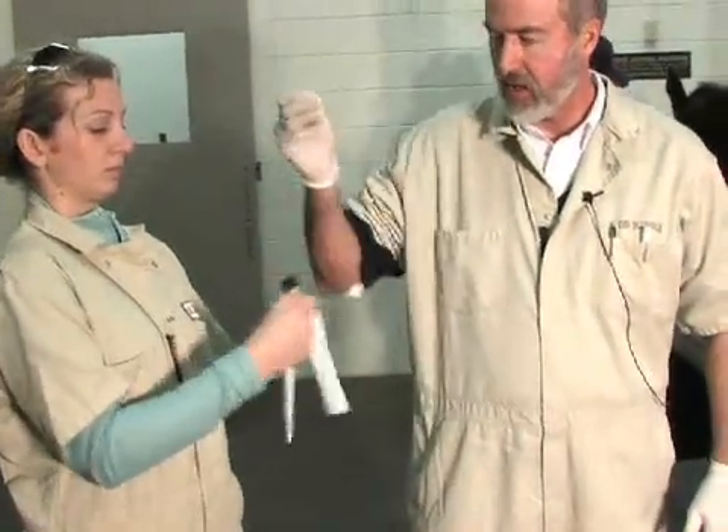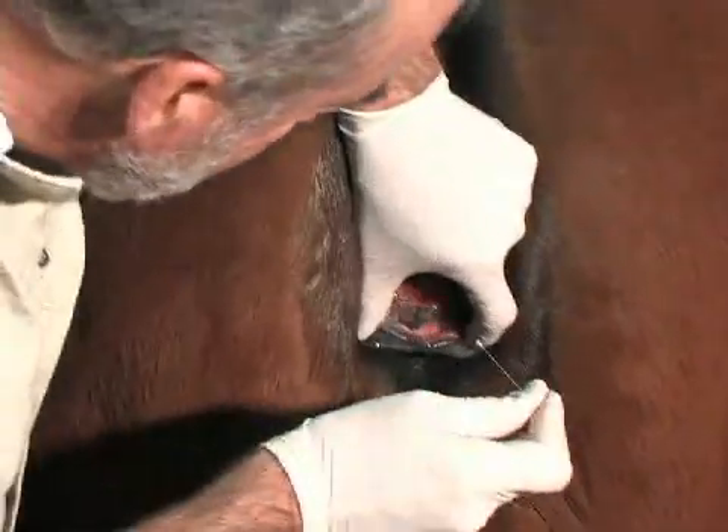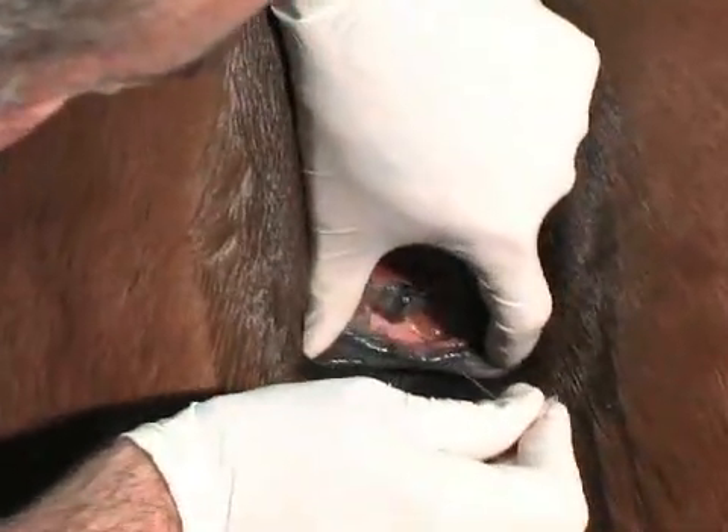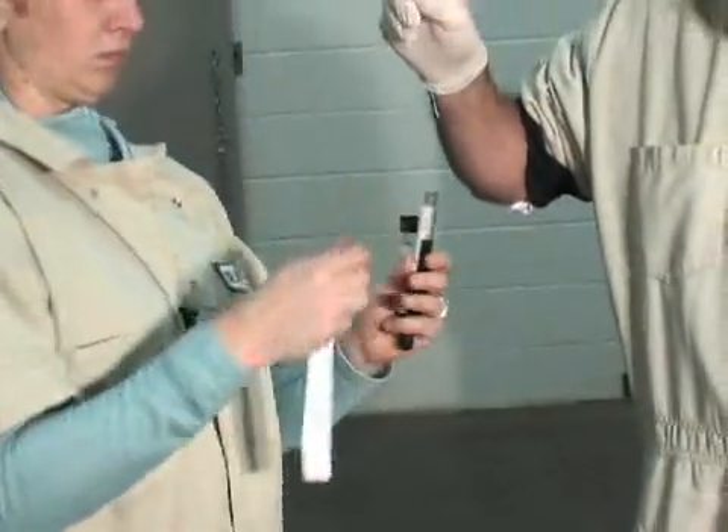We'll get this wire CalG swab. We'll go into the clitoral fossa, which is located just below the clitoris. We'll swab that area well and then we'll inoculate the Ames media.